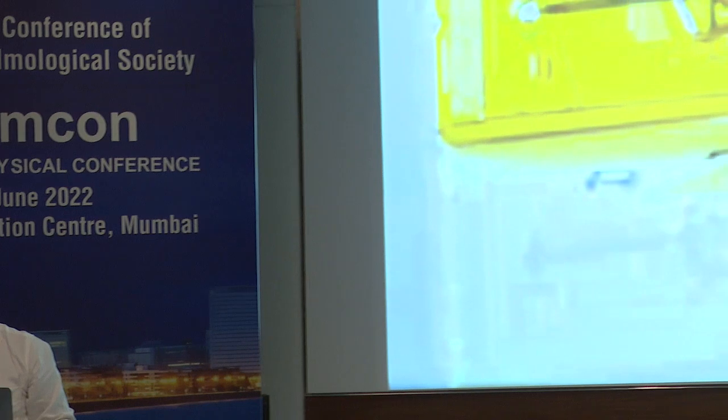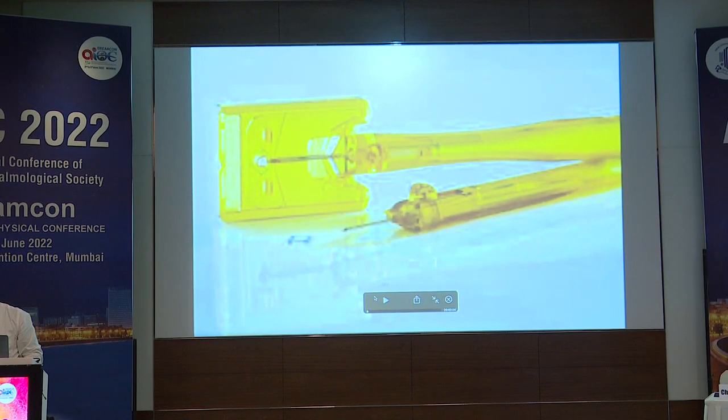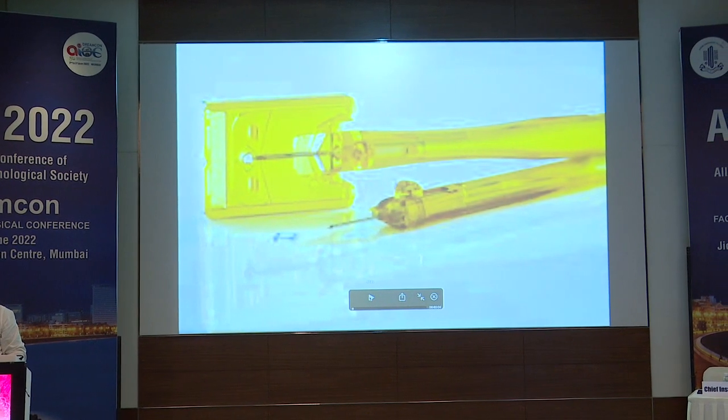We all know that small pupil always causes challenge to any phaco surgeon because of the poor visibility while doing all the steps of the phaco surgery, from capsulorhexis to nuclear fragmentation to each and every step. So if we use these expander devices, our life becomes much easier.